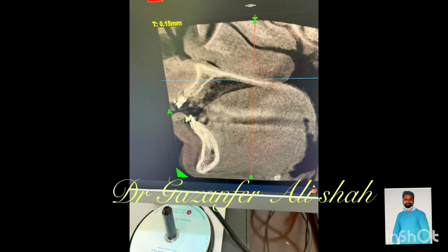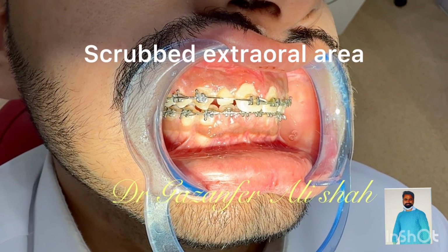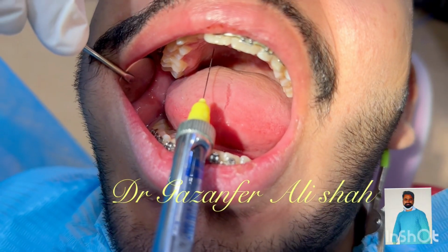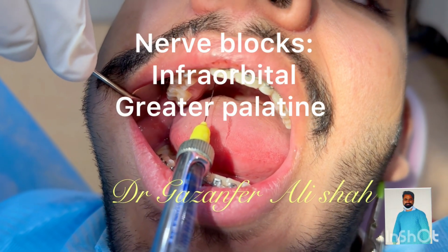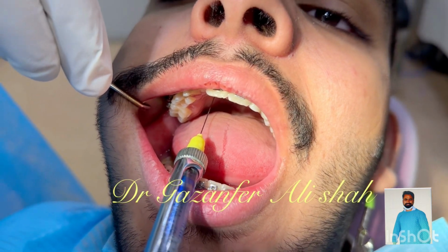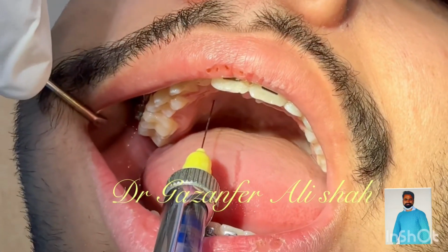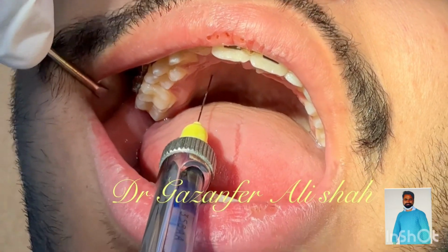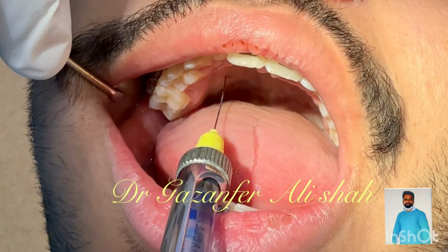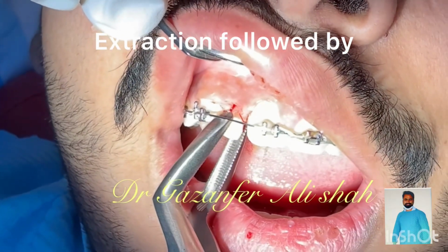We discussed risks and benefits of treatment with the patient and completed informed consent. After documentation of informed consent, we mopped the extraoral area and scrubbed it with betadine to decrease translocation of extraoral bacteria and decrease chance of infection. We are anesthetizing this area with greater palatine nerve block and infraorbital nerve block.